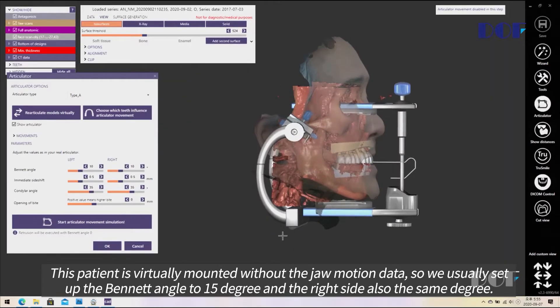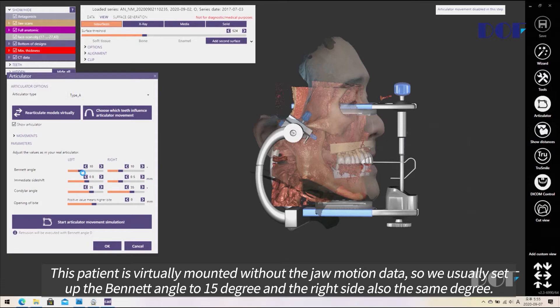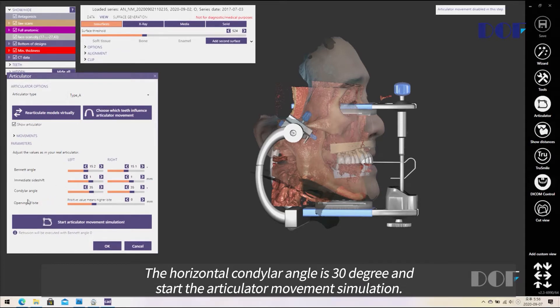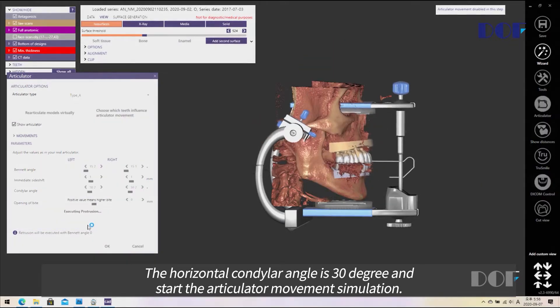This patient is arbitrarily mounted without jaw motion data. So we usually set the Bennett angle to fifteen degrees. The left side is also the same degree. The immediate side shift is one millimeter, and the horizontal condyle angle is thirty degrees. Then we start the simulation.